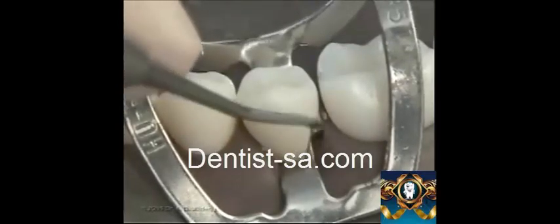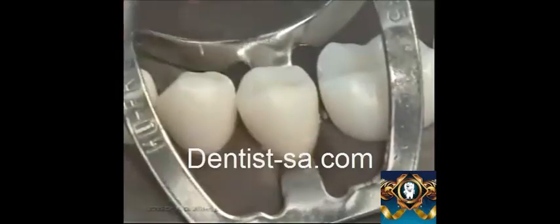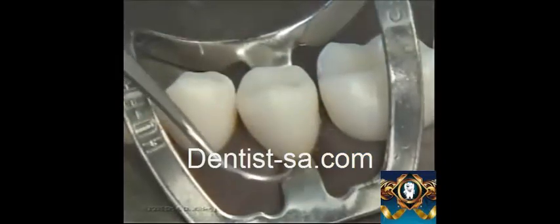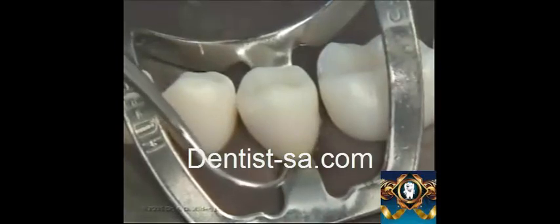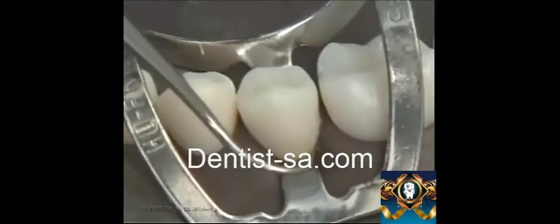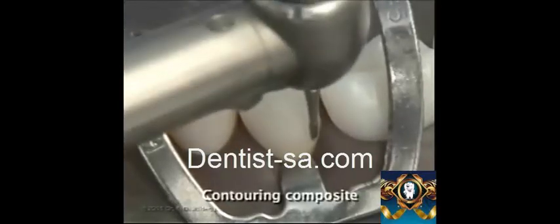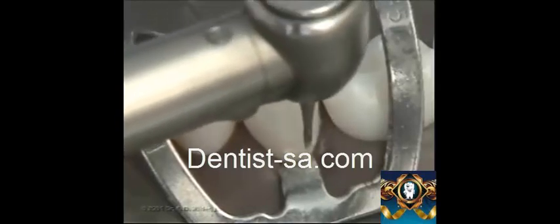Once a satisfactory contour has been obtained, light polymerization is done for 40 seconds or according to the manufacturer's instructions. An explorer is used to evaluate the cavo-surface margin for any excess or any deficiency, which could be filled up at this stage. The contouring procedure is started using a tungsten carbide burr of 18 to 24 flutes.